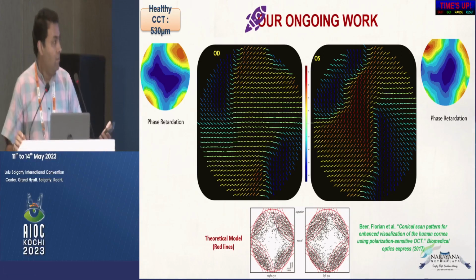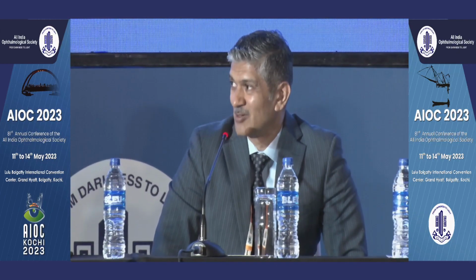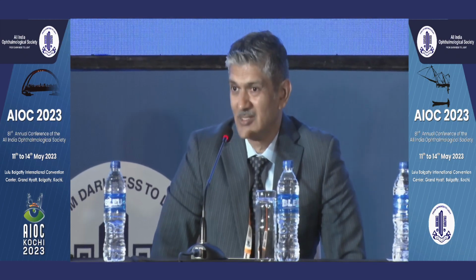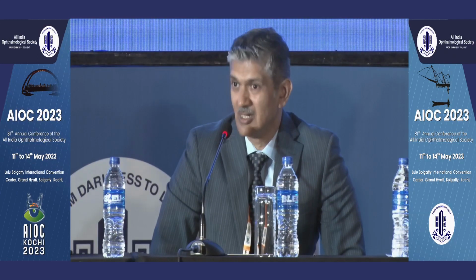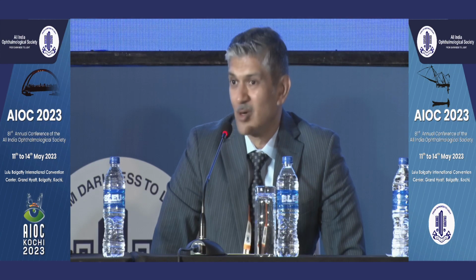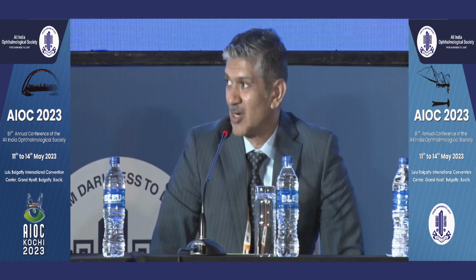Thank you, Dr. Rohit. Very interesting work that you are doing. I think this is more significant for countries like India, where our average refractive surgery patient's age is around 26 years, compared to the Western countries where it's 36. And we all know that with age, the collagen changes and gets cross-linked, so it's a little stronger. So probably the risk of ectasia in countries like ours, where we are treating a very young population, would be much higher. So that's where devices like this can provide us insight, where we are actually able to image the collagen.